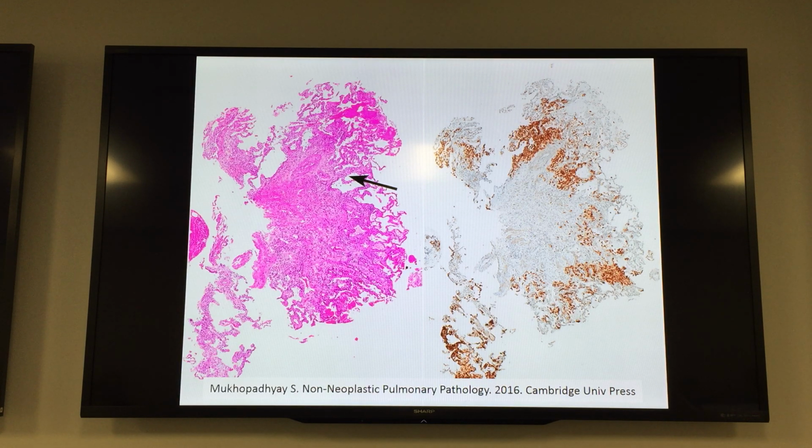non-neoplastic? Okay, can anybody tell me the 3 criteria for calling something a transbronch? Let's see. One of the first years, I want. Small. Not needle shaped. And it has alveoli. All right. We taught you one thing before you leave this lecture. That's great. So I want all of you, when you come to the lung rotation, to be at least armed with that information. Every time you see a biopsy, try to ask yourself, is this a transbronch or not?